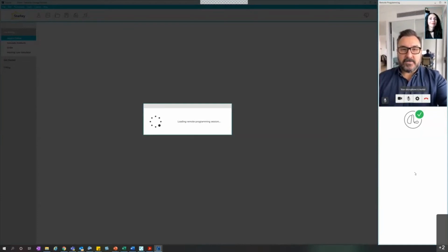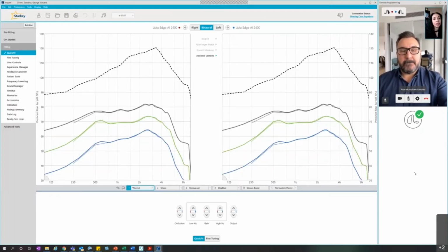I'm very good. How are you, Dr. Judy? I'm doing well. What can I help you with? You said you were having a few little issues, and I know due to the current lockdown, you're unable to come into the clinic today. So hopefully I can make the changes that you need remotely.